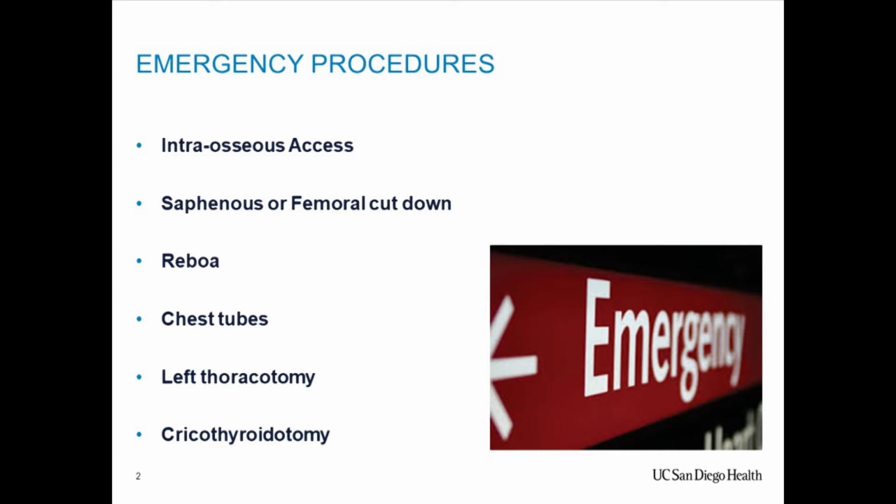So the issue with IOs is that the rate that they flow is a little bit different, and in fact, it will affect the quality of the scan that we get from radiology. So if we're doing anything with contrast, they're not ideal for that. But they're great for resuscitation. So we'll talk a little bit more about indications as we go through here. We'll start with the IO in general.